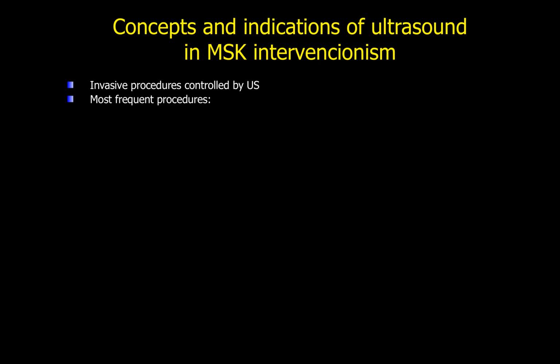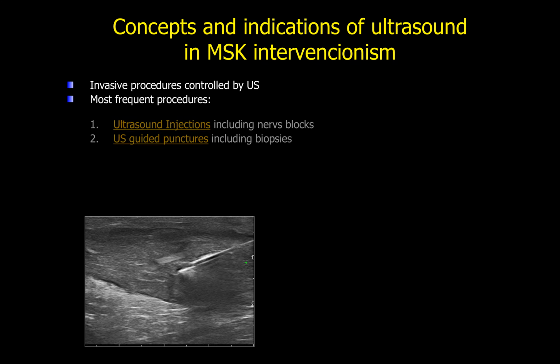Interventionism are invasive procedures controlled by ultrasound. The most frequent of them are injections, including nerve blocks, and also punctures, including biopsies.